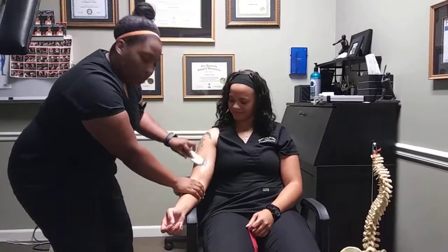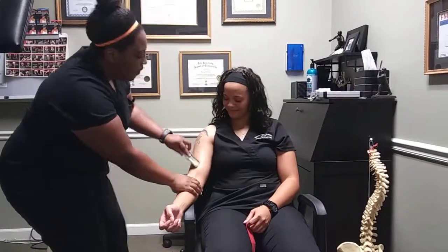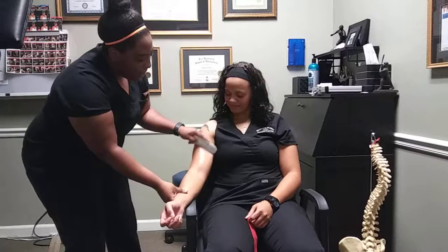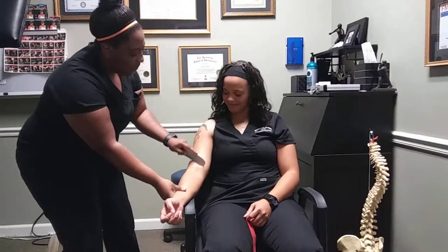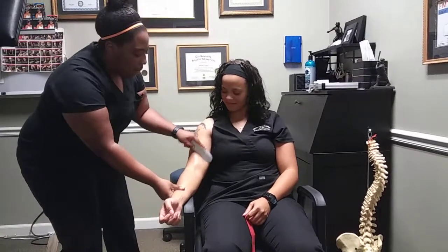We're going to do passive first, for about 30 seconds. You want to hold the tool at a 30 to 60 degree angle, getting in there breaking up that scar tissue and adhesion in that muscle.